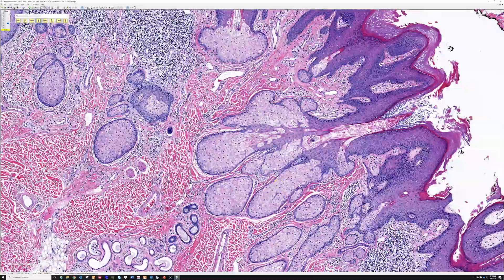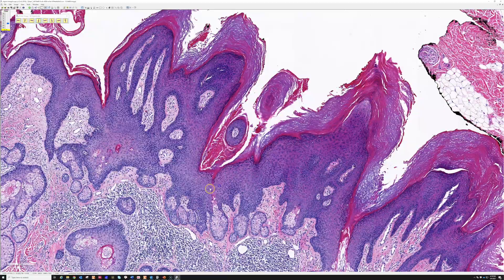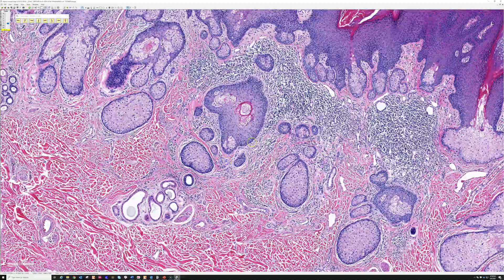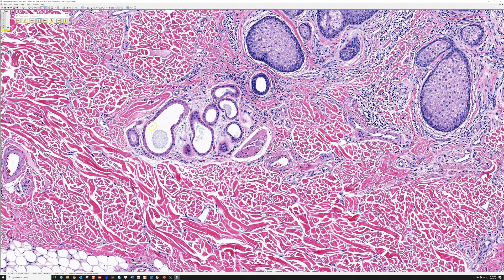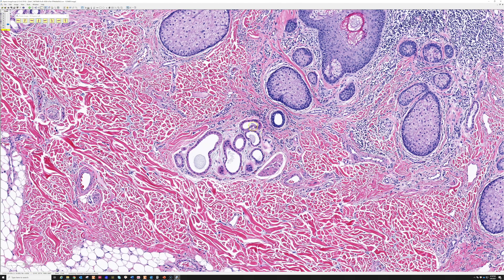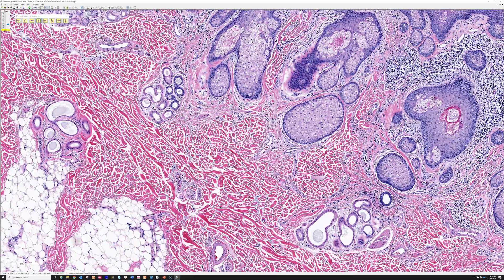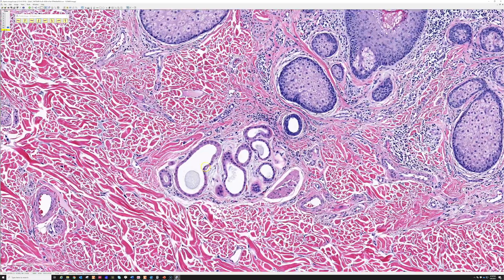Here are the large sebaceous glands — very nice, mature, benign sebaceous glands, but draining directly to the surface of the skin instead of into hair follicles. Point number three — and you don't always have this, but this case has it nicely, which is why it's one of my favorite examples — look at these glands. They're tangled together like eccrine glands, which is the normal gland that makes a little coil in the skin, but cytologically they don't look like eccrine glands.